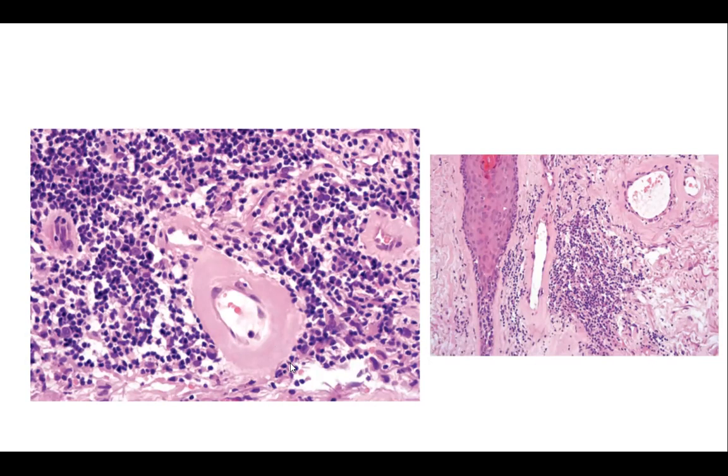So it's a leukocytoclastic lymphocytic vasculitis. So another neutrophilic leukocytoclastic vasculitis, leukocytoclastic lymphocytic vasculitis. Which entity is going to give you this feature? Cutaneous collagenous vasculopathy. Cutaneous collagenous vasculopathy usually would give us the thickening of the vessel wall, yes, but it's not a very inflammatory disorder. It's more of a vasculopathic disorder, which would not have that many lymphocytes around it.